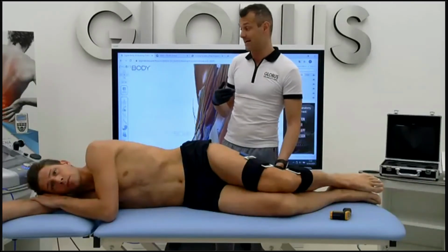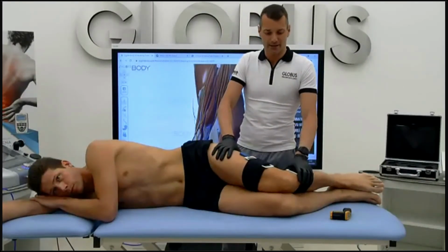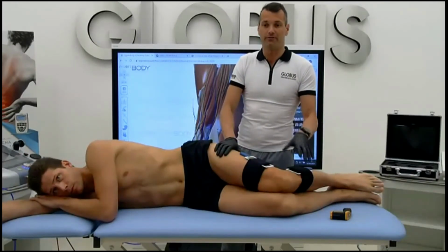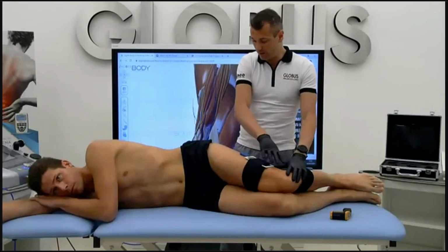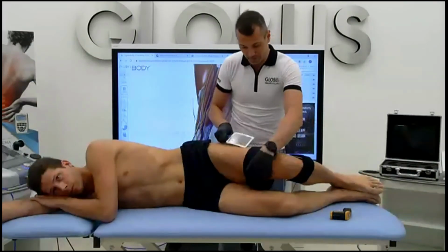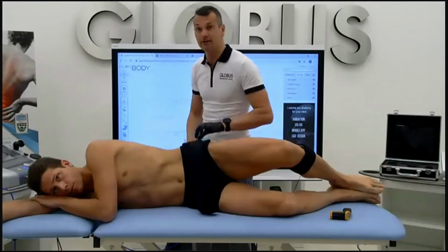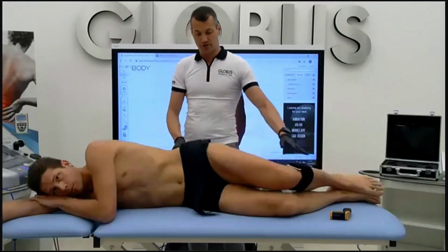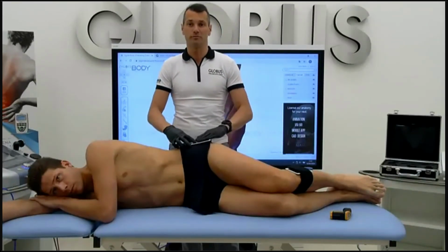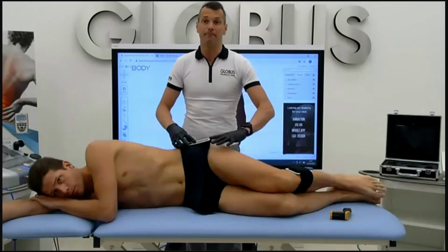We spoke last time about how to use the hands-free. Also, you can find it on the internet site. Short geometry: we can set up 20 to 30 watts for treating just this area, or we can use a medium or large geometry. Maybe we can put the band on this part here, and put the blade straight on the lateral part, for example on the fascia lata, on the gluteus minimus, to have all the energy through the iliotibial band.